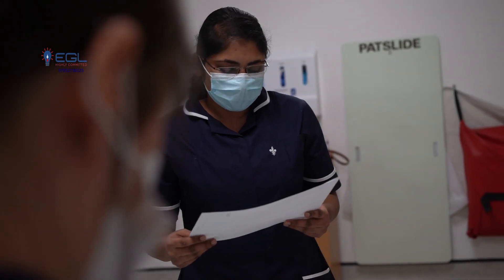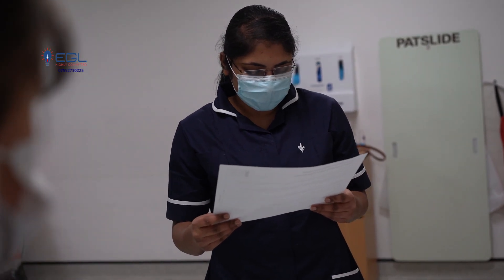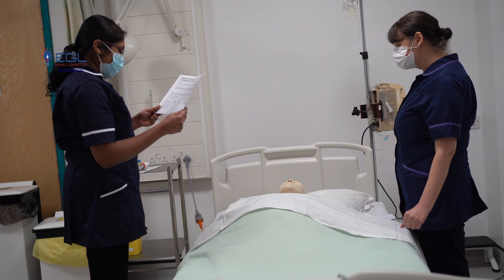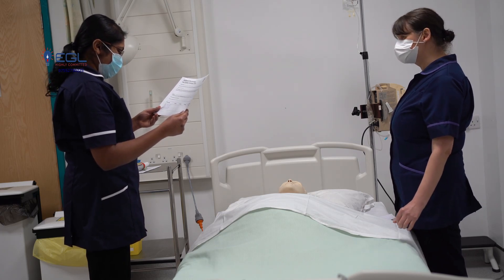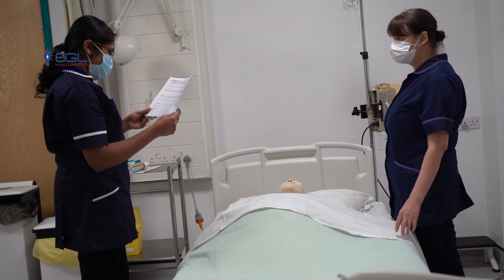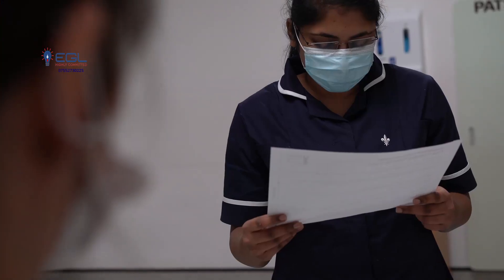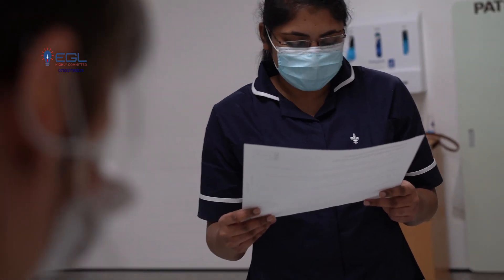Before proceeding further, could you tell me your full name please? It's Peter Williams. And your first line of address? Number 2 Longstreet. And your date of birth please? 28th January 1952. Do you have any allergies? No, nothing I know of. Do you know your height? I think I am about 160cm.